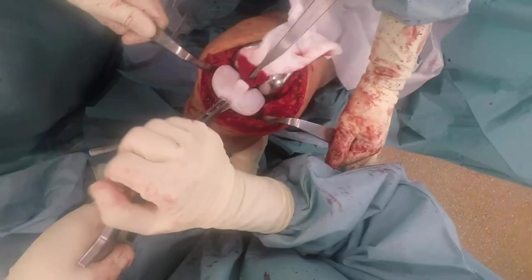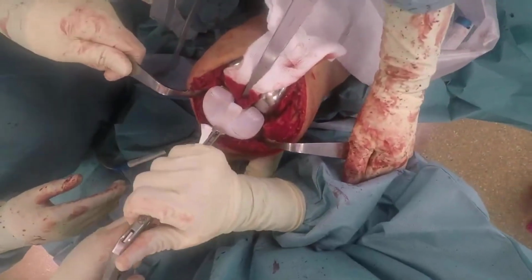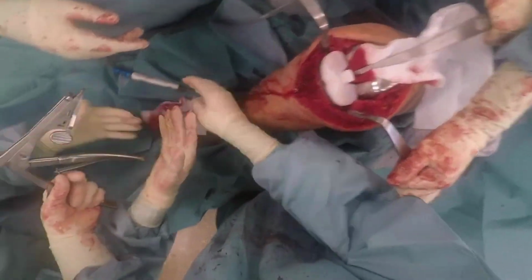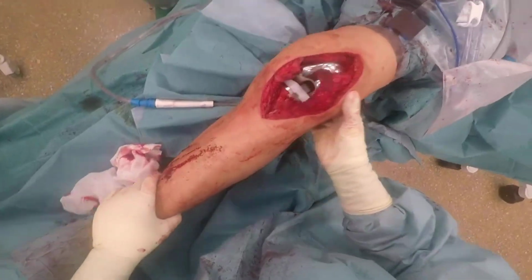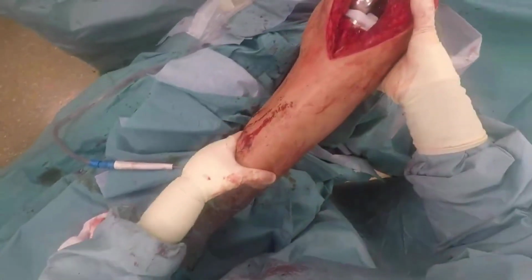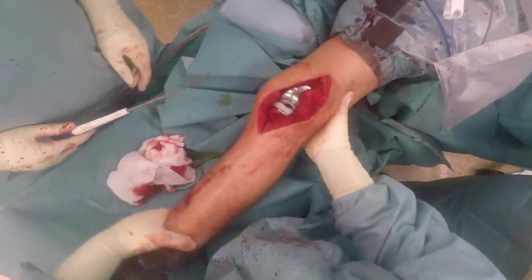The purpose of this plastic component, which is very resistant to wear, is to artificially reproduce the joint space between the femur and tibia, thus preventing the two metal components from touching each other. Now all the components are in place and stable, all that remains is to check the mobility and stability of the knee once again.